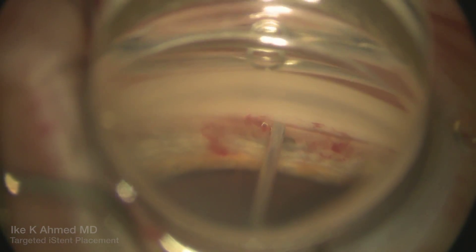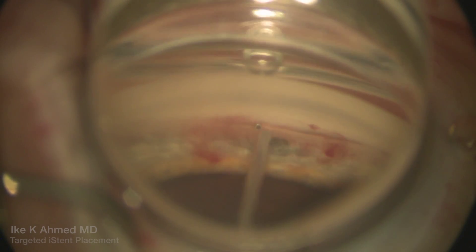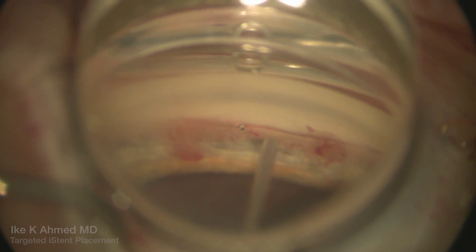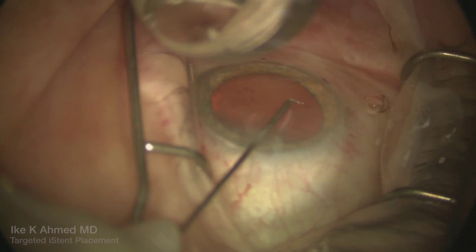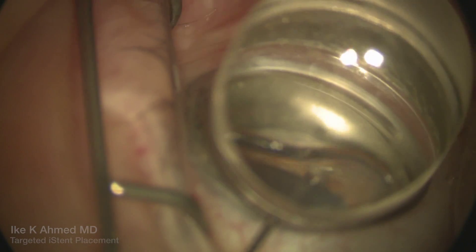Most of these aqueous veins are present more in the inferior quadrant, as has been shown by previous studies. We identify here again an infranasal area where we place the stent. Although there was no blood reflux initially after placement of the eye stent within the canal, we then see blood reflux emerge.